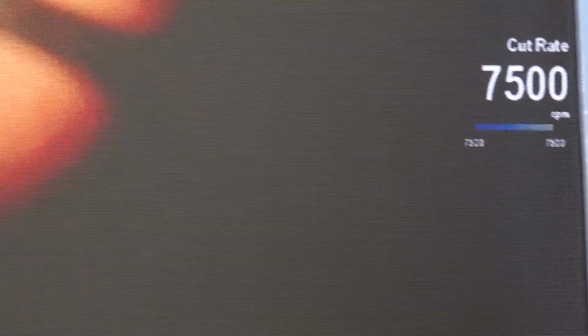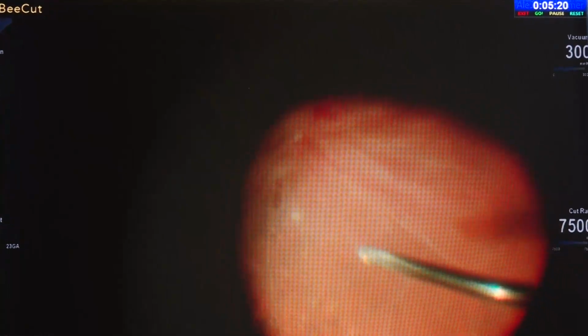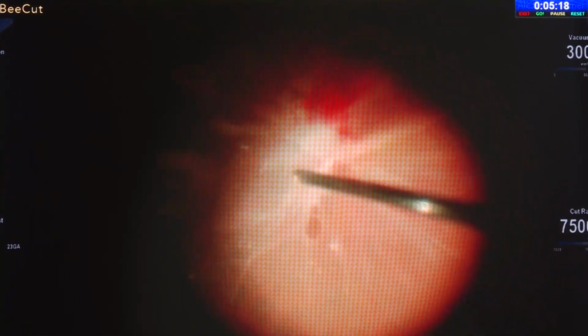So this is another situation where this is a combined retinal detachment. Here actually the whole retina is like a closed funnel at the disc. So the Sangeet's technique might not work here because the retina is also like inside. It's like one bunch which has gone inside the disc. So here the advantage is that you should do center to periphery dissection, especially in combined retinal detachment.